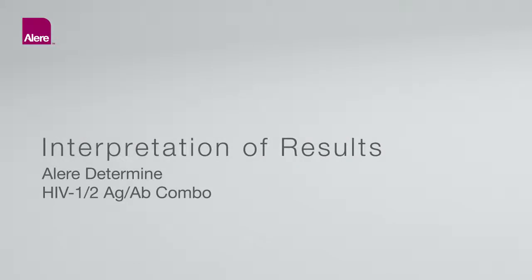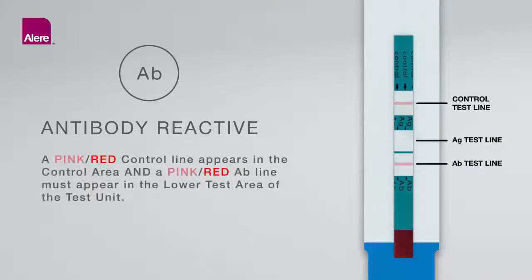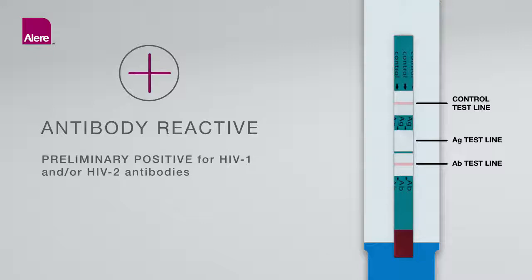Interpretation of Results — Antibody Reactive (Two lines: control line and antibody line): A pink-red control line appears in the control area and a pink-red antibody line appears in the lower test area of the test unit. The intensity of the antibody and control lines may vary. Any visible pink-red color in both the control and lower test areas, regardless of intensity, is considered reactive. A reactive test result means that HIV-1 and/or HIV-2 antibodies have been detected in the specimen and the test result is interpreted as preliminary positive for HIV-1 and/or HIV-2 antibodies.